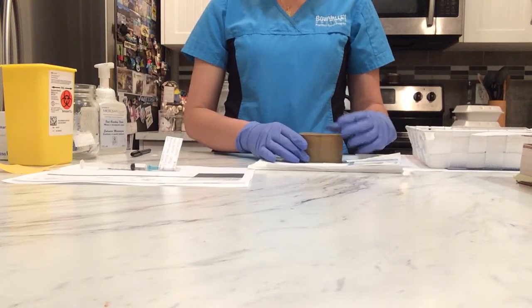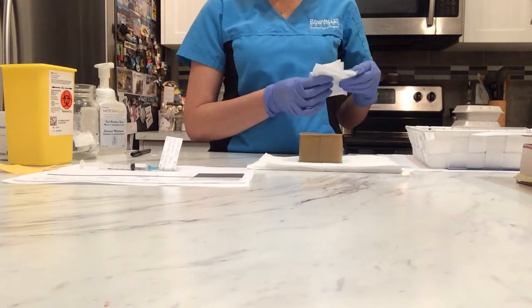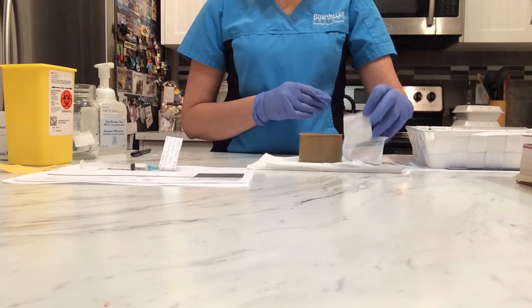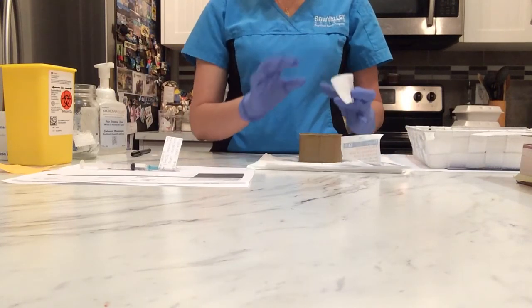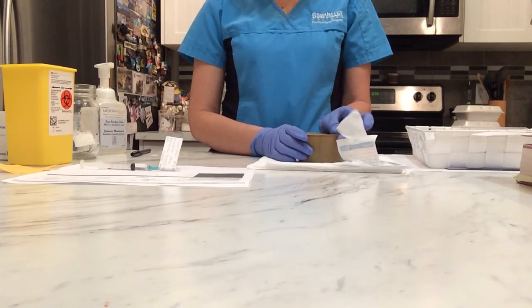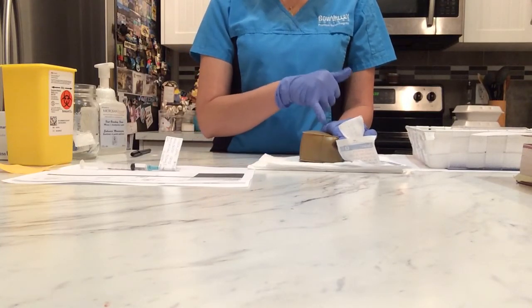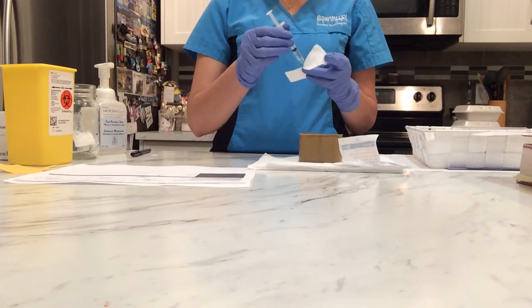Okay, now it's air dry. I'm going to get ready the gauze. And I'm going to put it in my fingers here, so it will be closer, and I'm going to hold it a little tight. And I know I made a mark there, and I'm going to inject my medication there.